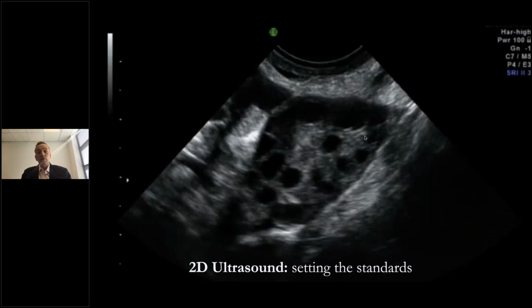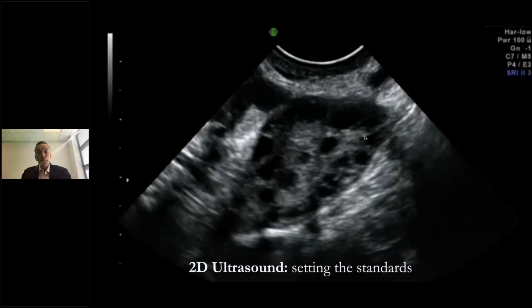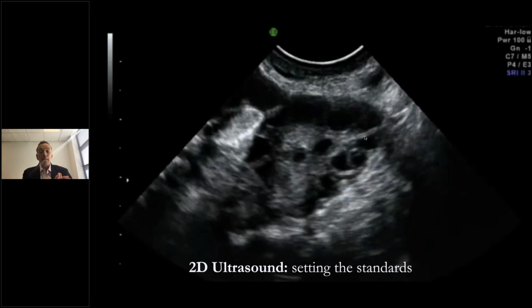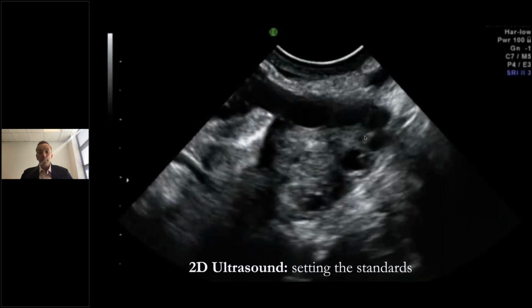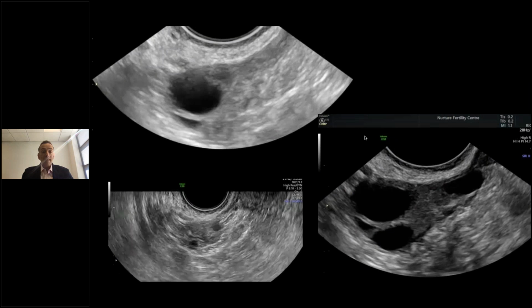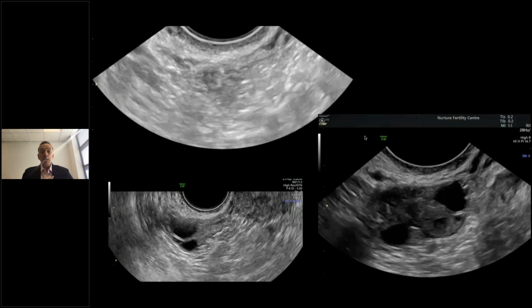So ultrasound, particularly 2D ultrasound, is a very dynamic thing. You've got to be able to modify the image to accentuate what you want to look at. And when you're looking at follicles, the follicles need to stand out. So you might need to use a different approach than when you're looking at standard imaging. And we've just worked on a white paper with GE that will be available, looking at basic 2D settings to maximize follicle counts, the appearance of the endometrium and so on.